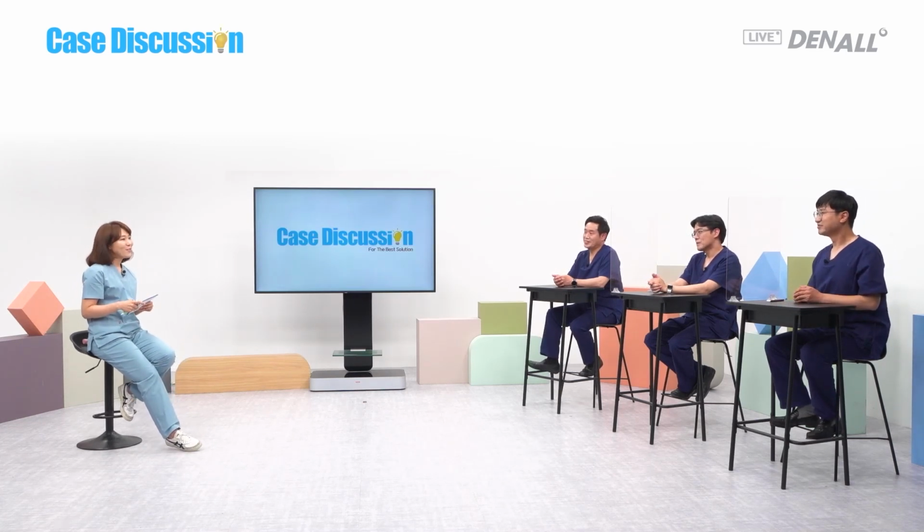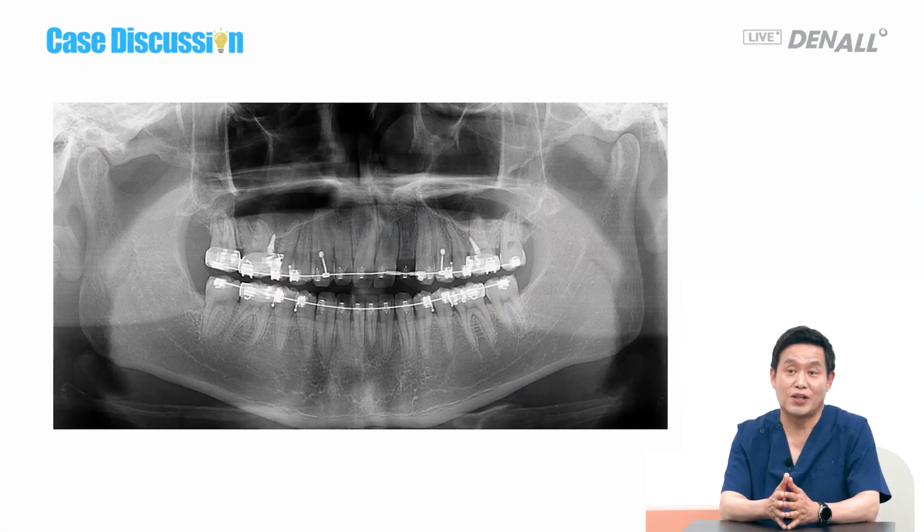The three panelists gave us very good advices. Let's go back to the case under discussion. Based on what we have discussed, then what's your last remarks? That case, we need to use narrow implant. As Dr. Park said, 3.0 millimeter. Placing it is even not easy. Digital guide and Osstem's one guide is available, but therefore they can be used to place the implant as planned. In this case, GBR is necessary.